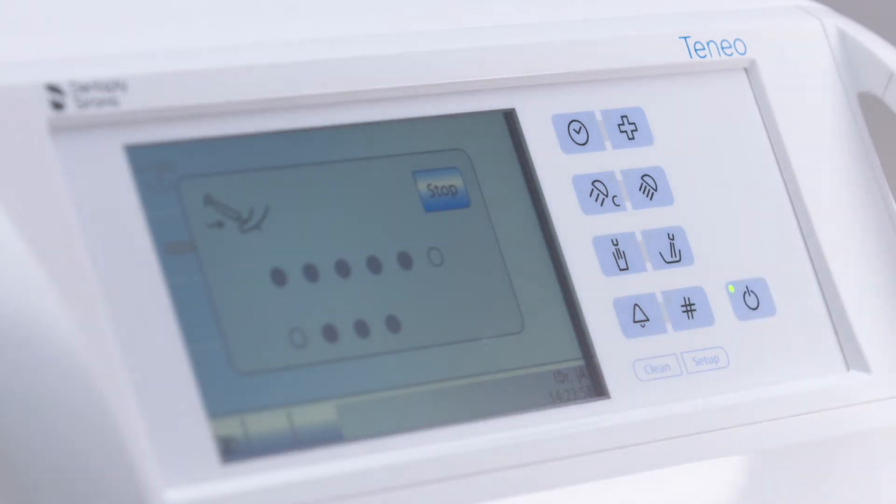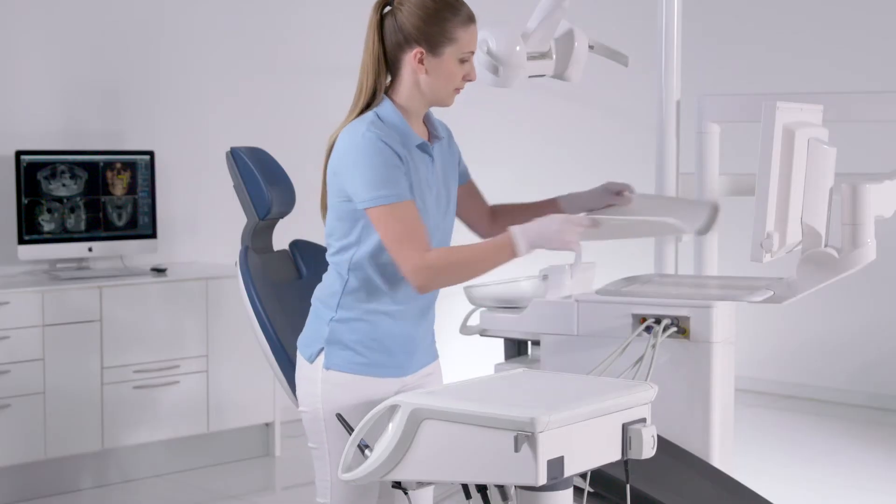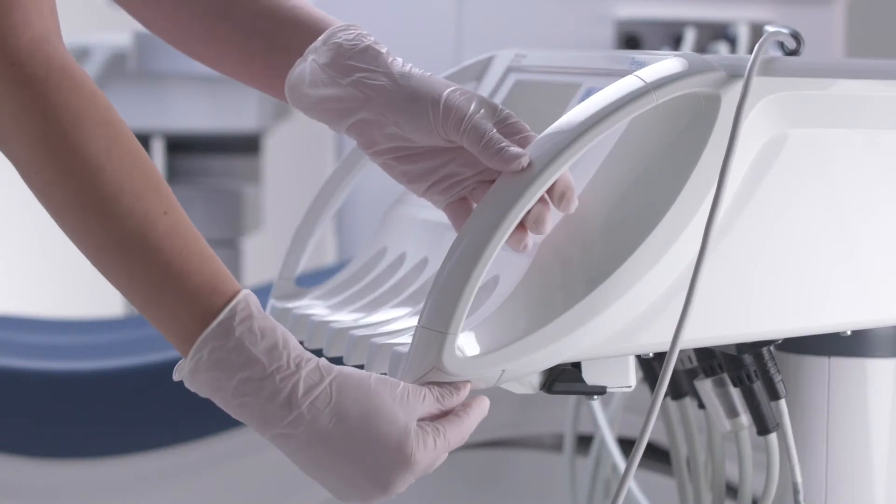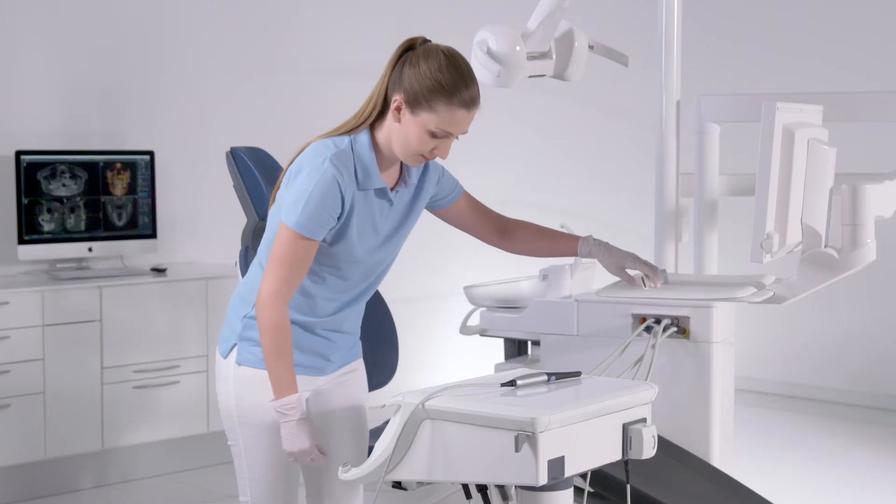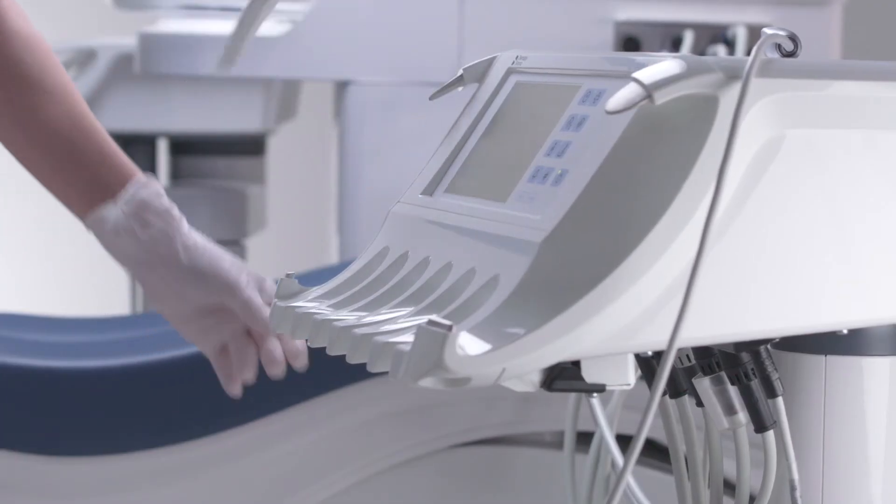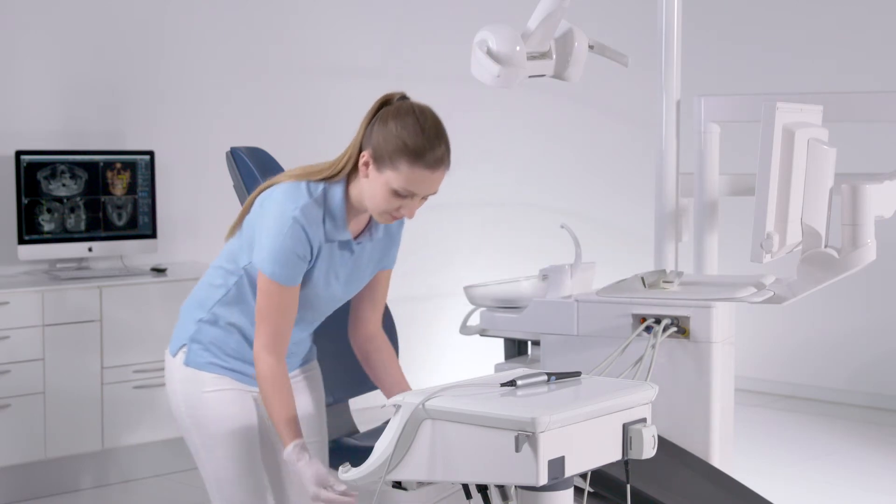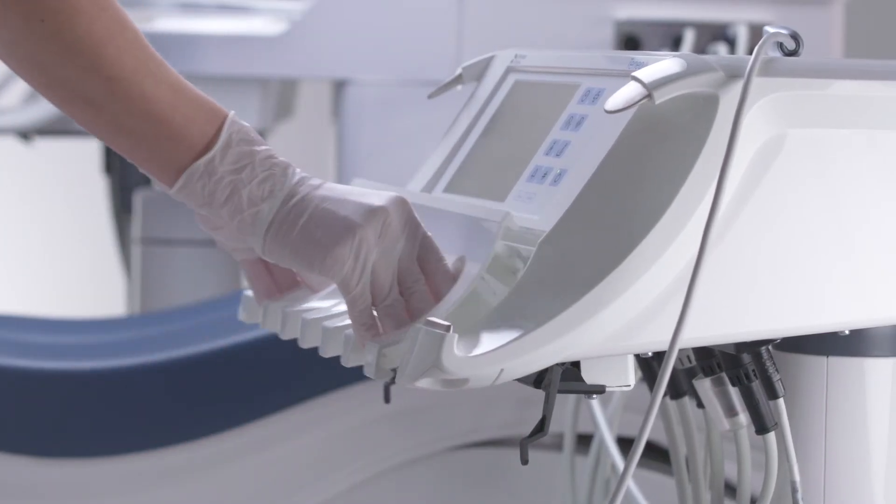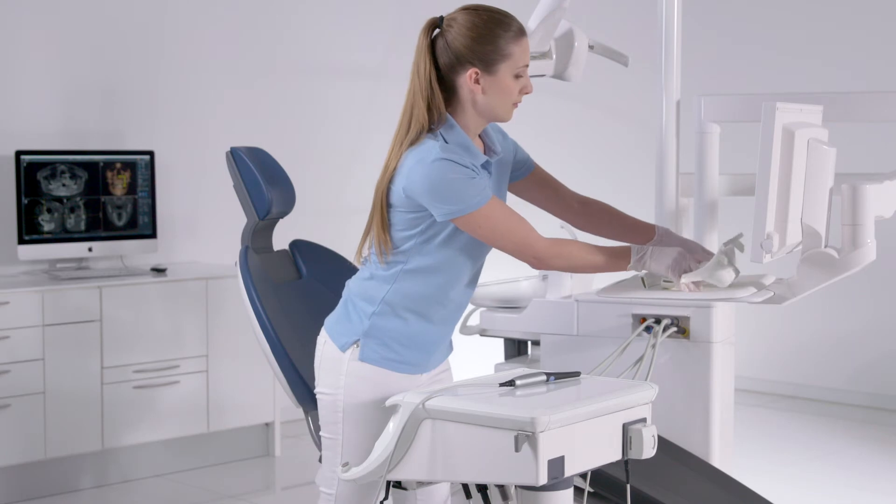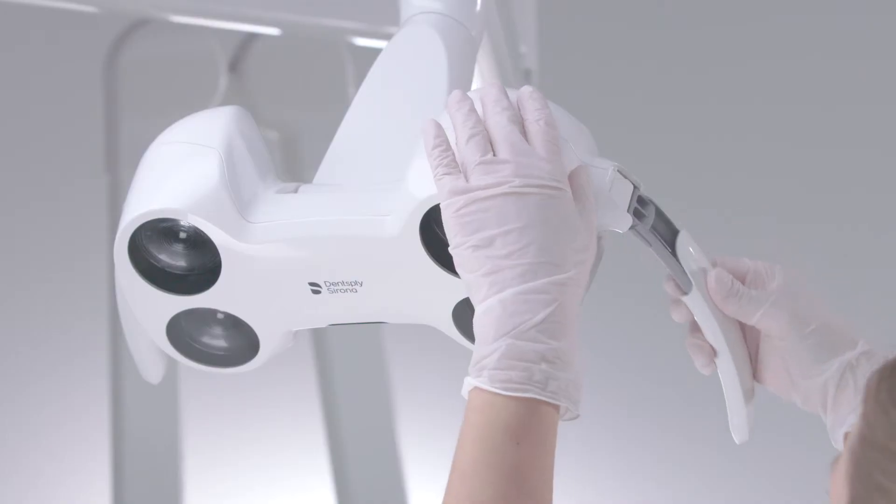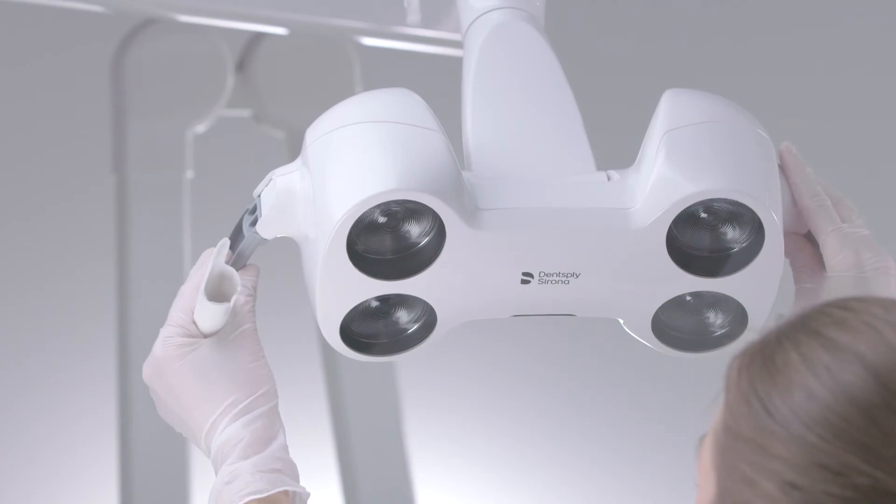Next, switch the treatment center off at the main switch. Remove all hygiene critical parts for reprocessing. The instrument holders on the dentist and assistant element, the handles of the dentist element, and the tray can all be thermo disinfected. The silicone pads and the handles of the operating light can be sterilized.